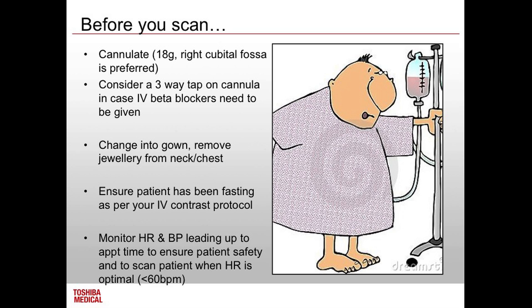Quality of the scan? Yeah, you would get artifact. So you guys have got CMAR, right? CMAR can be used on cardiac scans. They're on ECG gated scans, I'm pretty sure, but I'd have to double check that. That could change things a little bit, but I probably would still do it and see how it went.